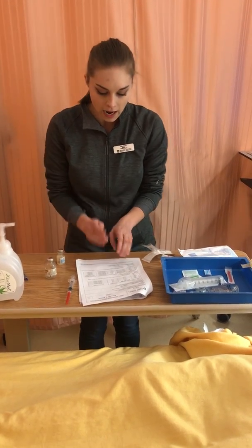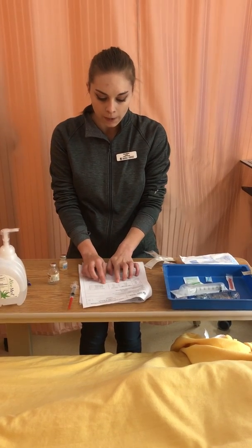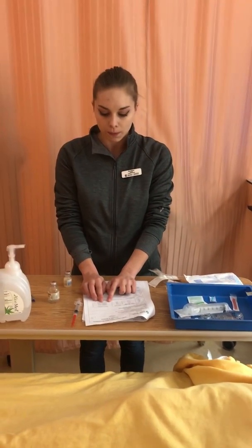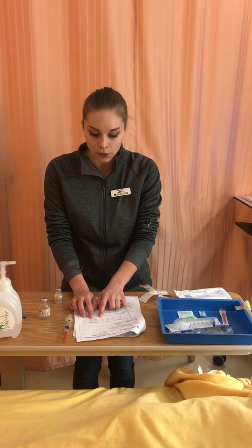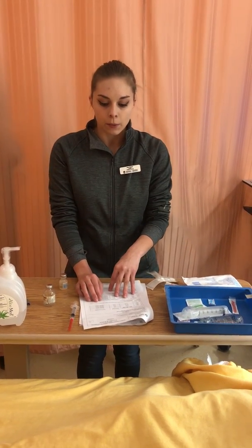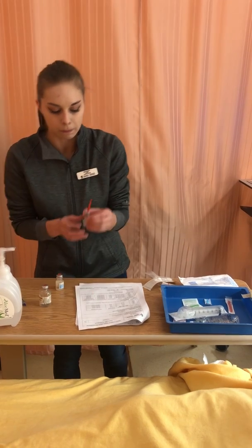While I'm letting it dry, I can do my math. So for a final concentration in this 5 million unit vial, it's 1 million units per 1 mL with a final volume of 5 mLs. So using cross multiplication, I will find out that I need 3 mLs to get my required dose of 3 million units. So that's what I'm going to withdraw.